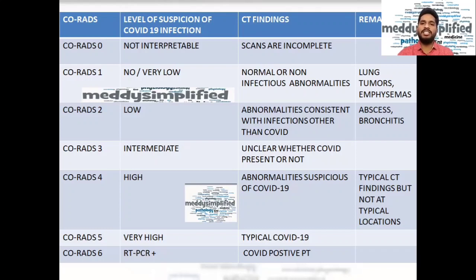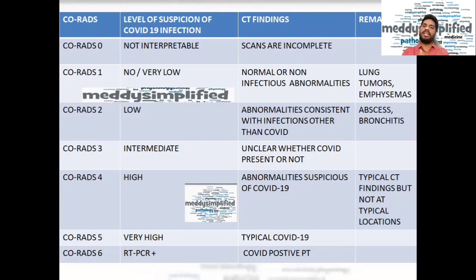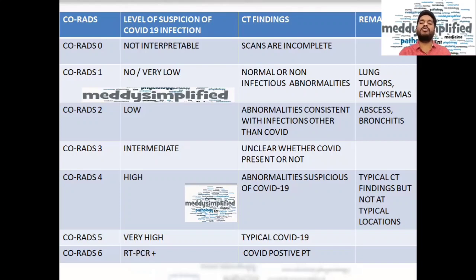CORADS 4 is high suspicion of having COVID-19 infection. The typical CT findings for COVID-19 are present, but not at a typical location. In CORADS 5, which is very high suspicion, the typical COVID-19 abnormalities are multifocal and widespread. In CORADS 4, the lesions are unifocal — present on one side — whereas if they are multifocal, we call it CORADS 5, indicating very high suspicion that the patient has COVID-19.